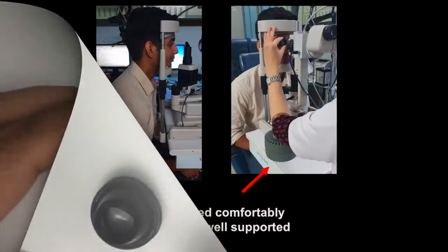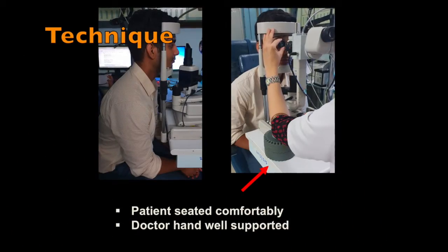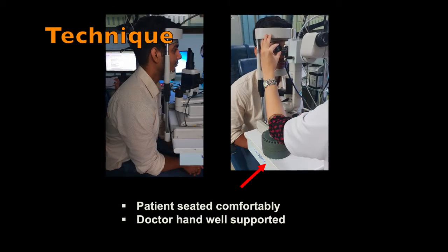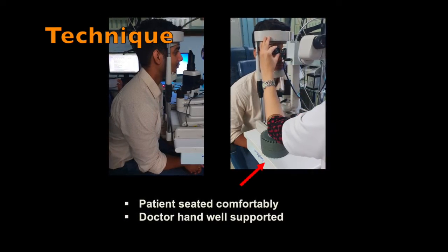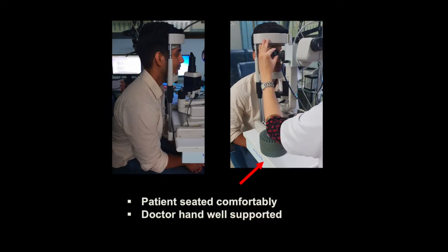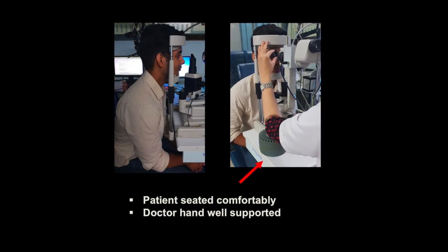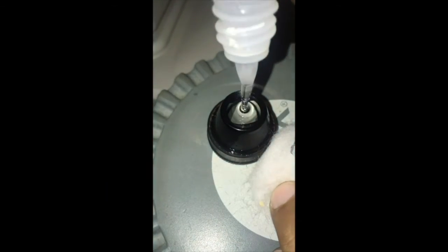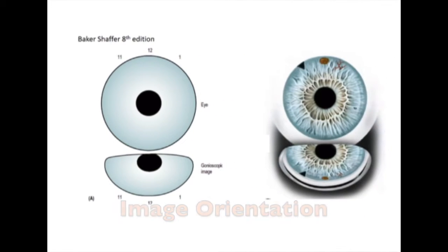The patient is seated comfortably and the doctor's hand is well supported. Gonioscopy is performed under topical anesthesia in a dark room using a short beam of light to minimize pupil constriction. Always start with a low magnification. For a two-mirror gonioscopy, a coupling fluid is required. In indirect gonioscopy, an inverted image of the opposite angle is seen, but the right-left orientation remains unchanged.